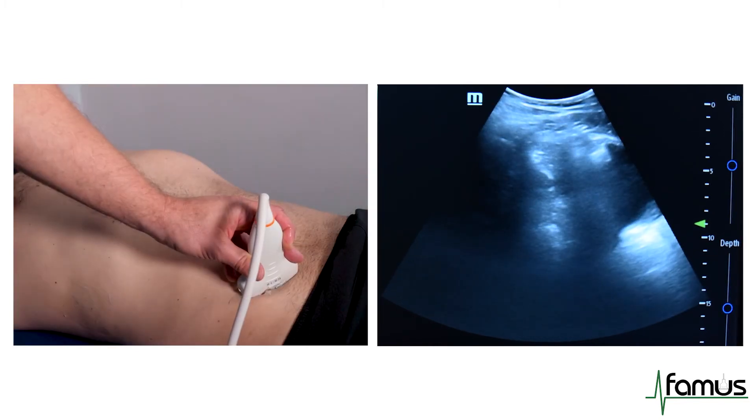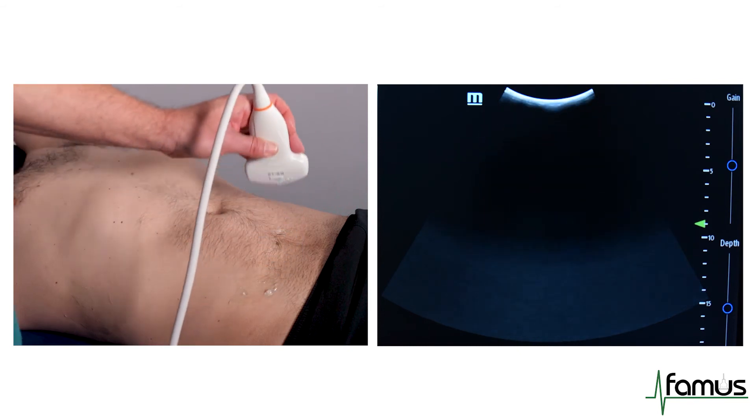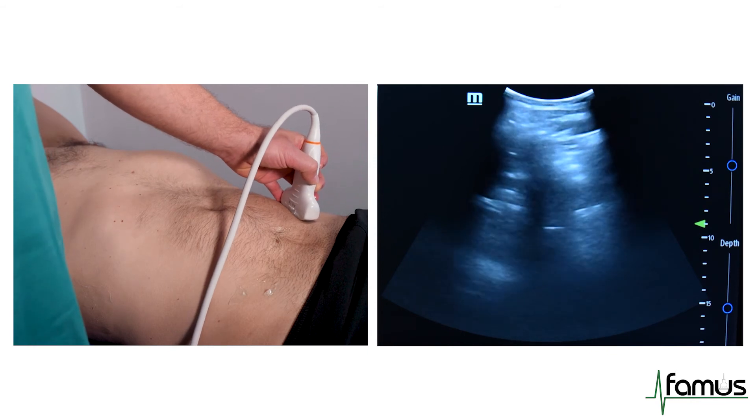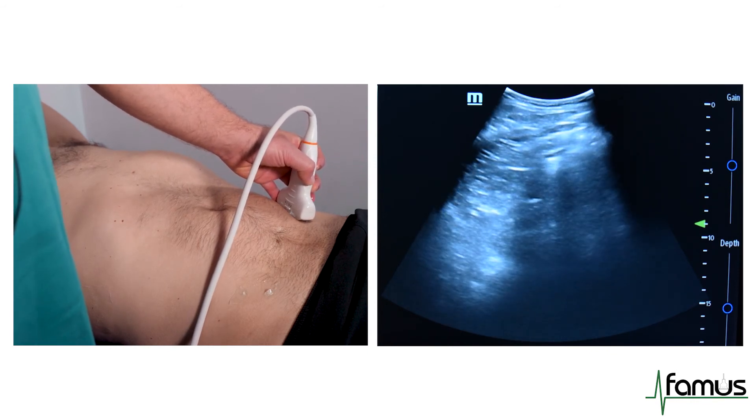We will then move to the left iliac fossa. And again, there is no free fluid to be seen.